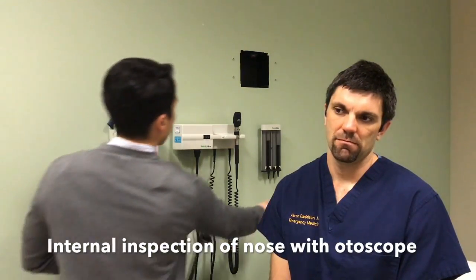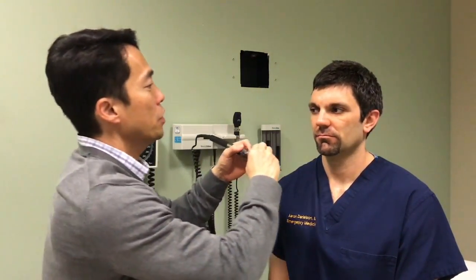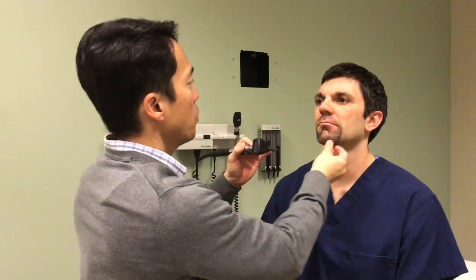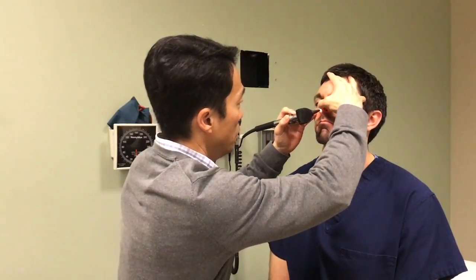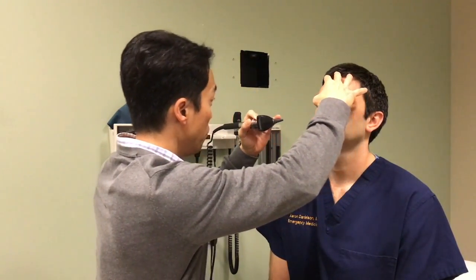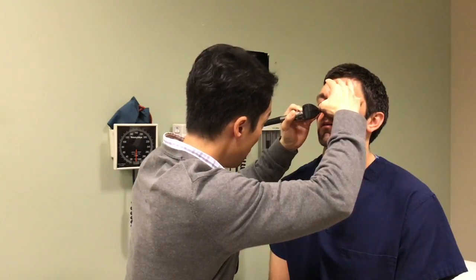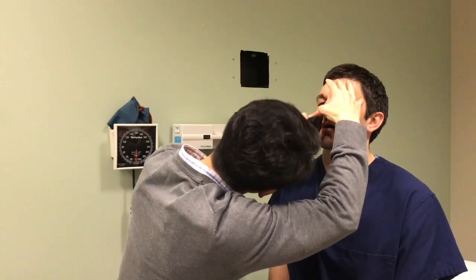For the internal inspection of the nose, we will again be using the otoscope. After replacing the speculum tip, hold the otoscope horizontally using the same grip. Have the patient tilt his head back slightly and insert the speculum directed posteriorly to observe the septum and lower turbinate. Then tilt the speculum upward to observe the septum and the middle turbinate. Be careful to avoid touching the sensitive nasal septum. Repeat with the other nostril.